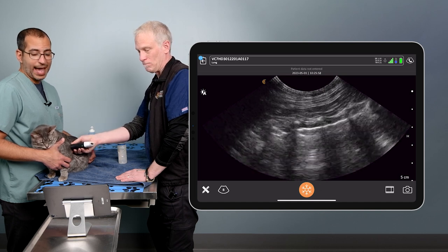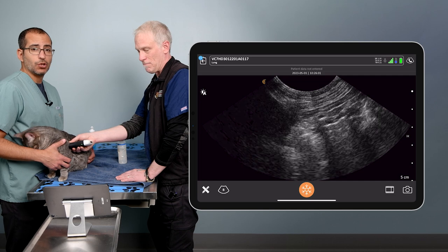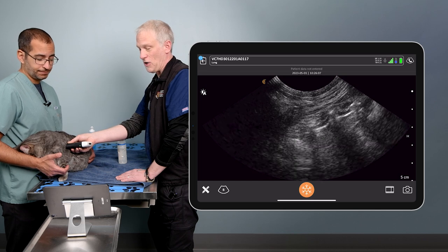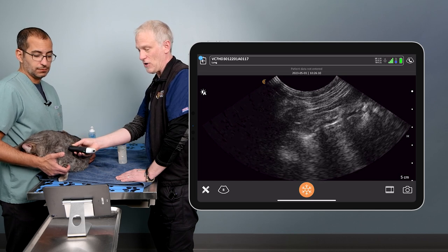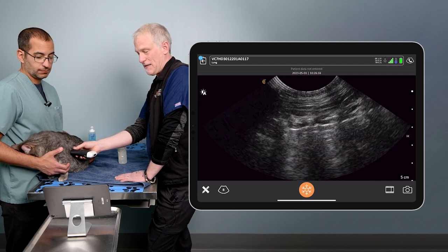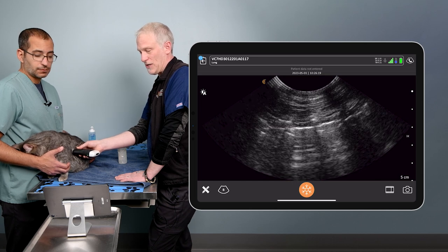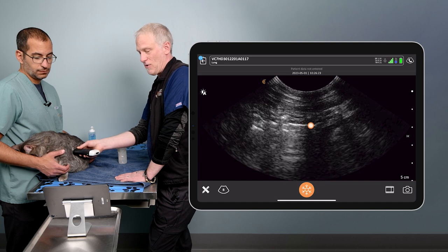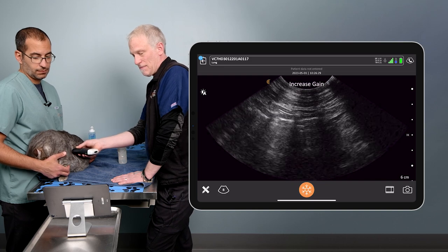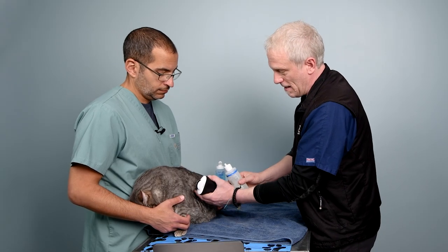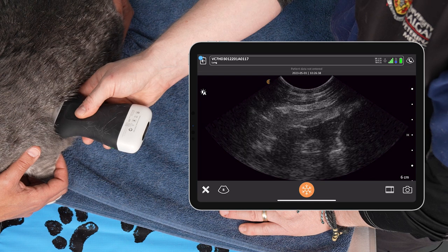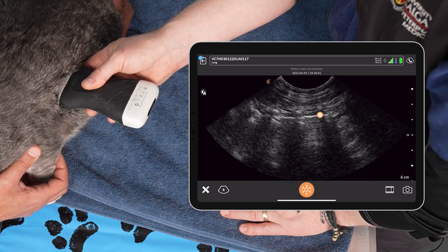Now we start scanning in a big S-shaped pattern, essentially trying to cover as much lung as possible looking for alveolar interstitial disease — an increased number of B-lines or lung consolidations. Going as far cranial as possible in the dorsal third, if there's no pathology, we drop down to mid thorax, then come back until we find that curtain sign again at the caudal border, looking for pathology as we go. Using voice commands to increase depth and gain makes that caudal border a little easier to see. We'll apply another shot of alcohol to improve the image of that curtain sign.